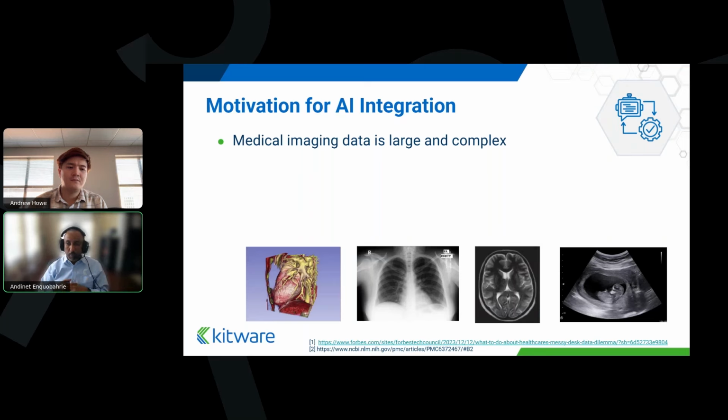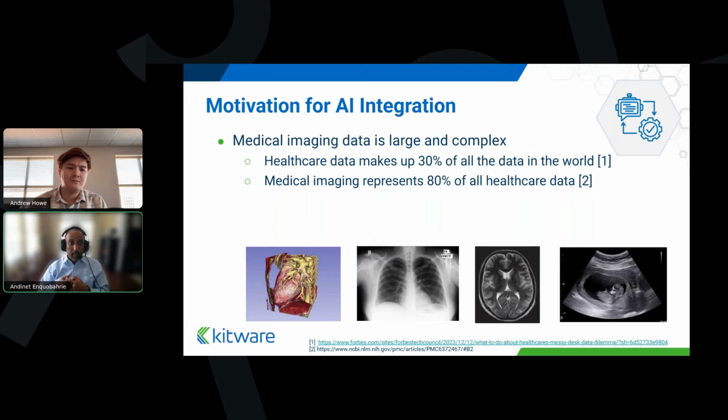There's a whole complexity of different types of modalities, and that requires some help or automation. And as you know, healthcare makes up more than 30% of all the data generated in the world. Medical imaging specifically makes up 80% of all healthcare data. So it's a huge amount of data. This necessitates AI automation.